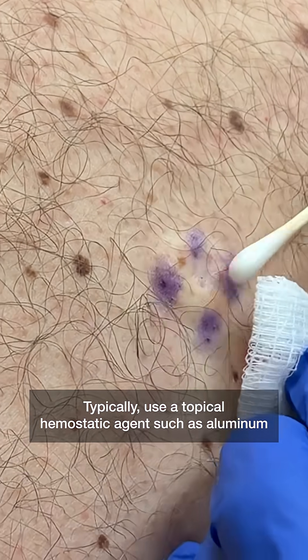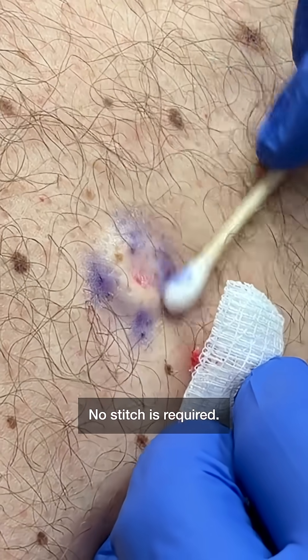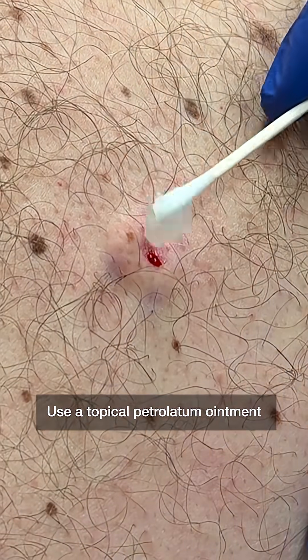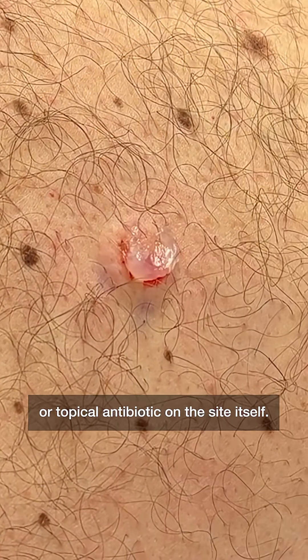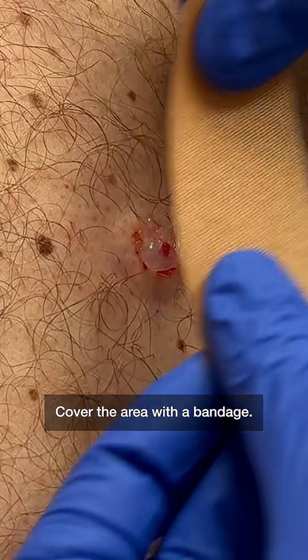Use a topical hemostatic agent such as aluminum chloride to decrease bleeding. No stitches required. Use a topical petrolatum ointment or topical antibiotic on the site itself. Cover the area with a bandage.